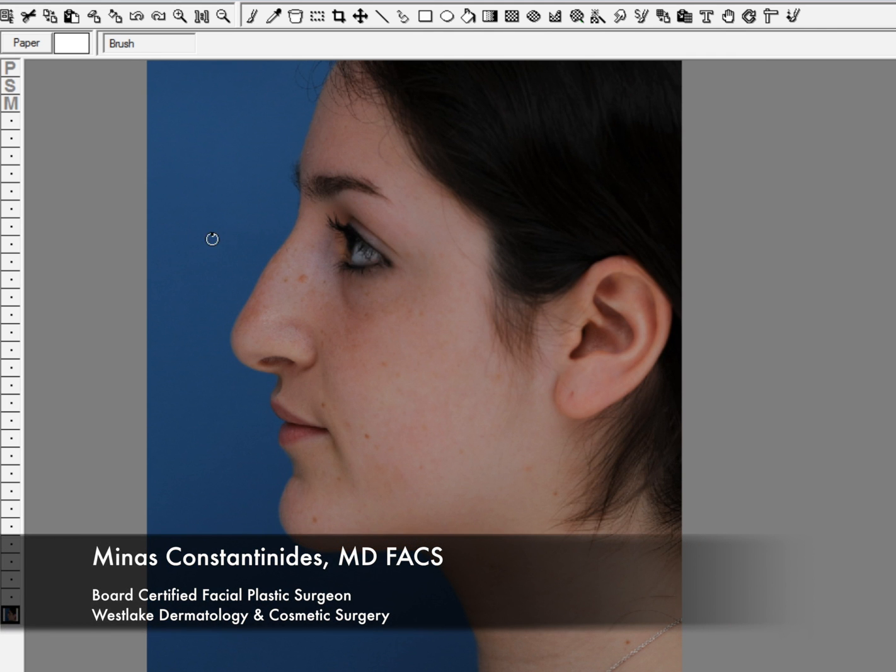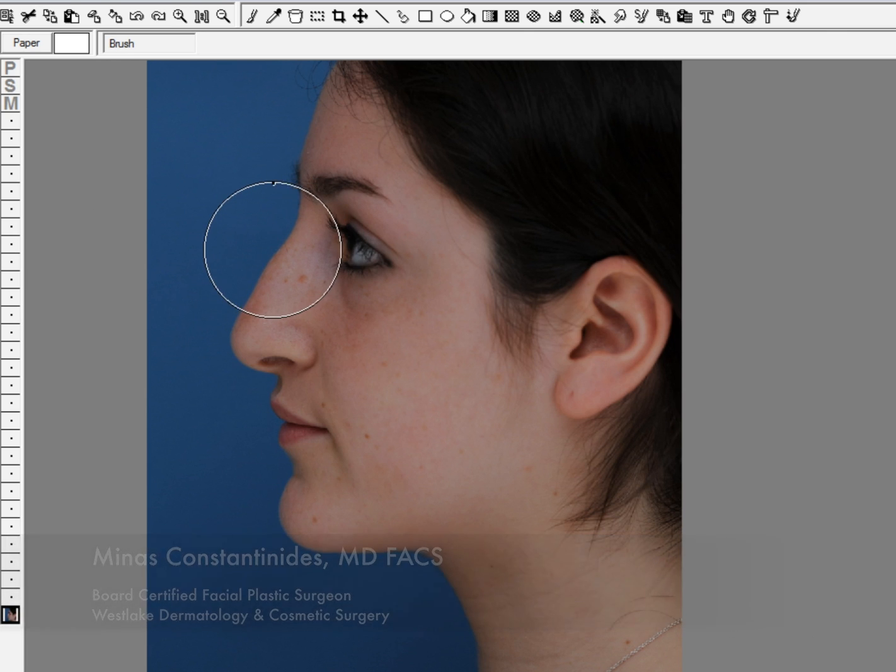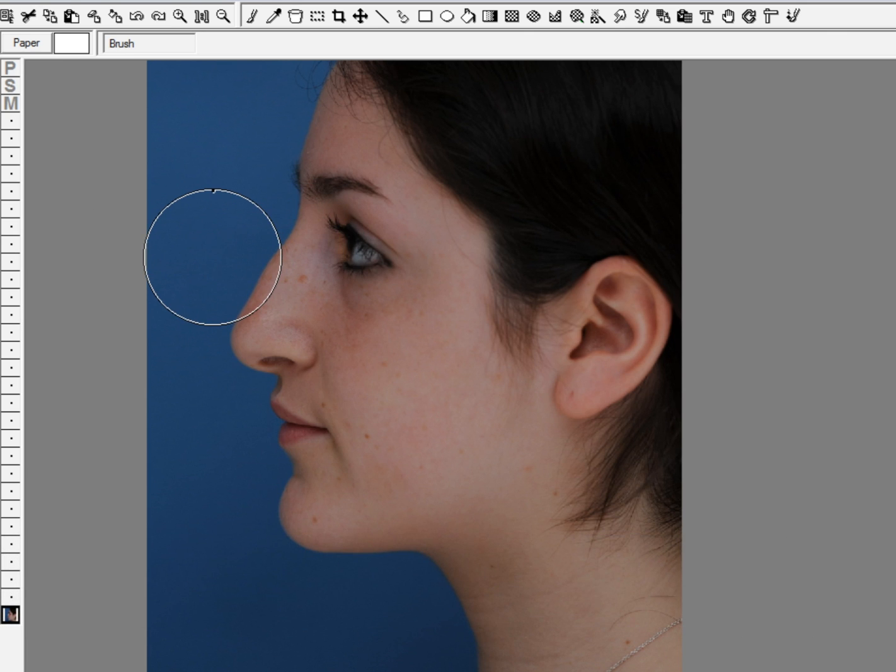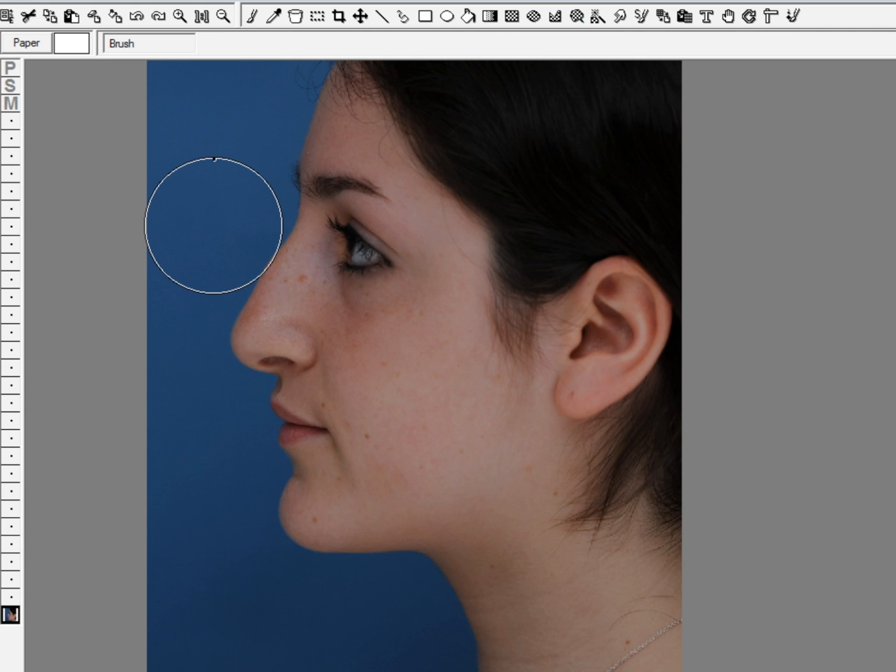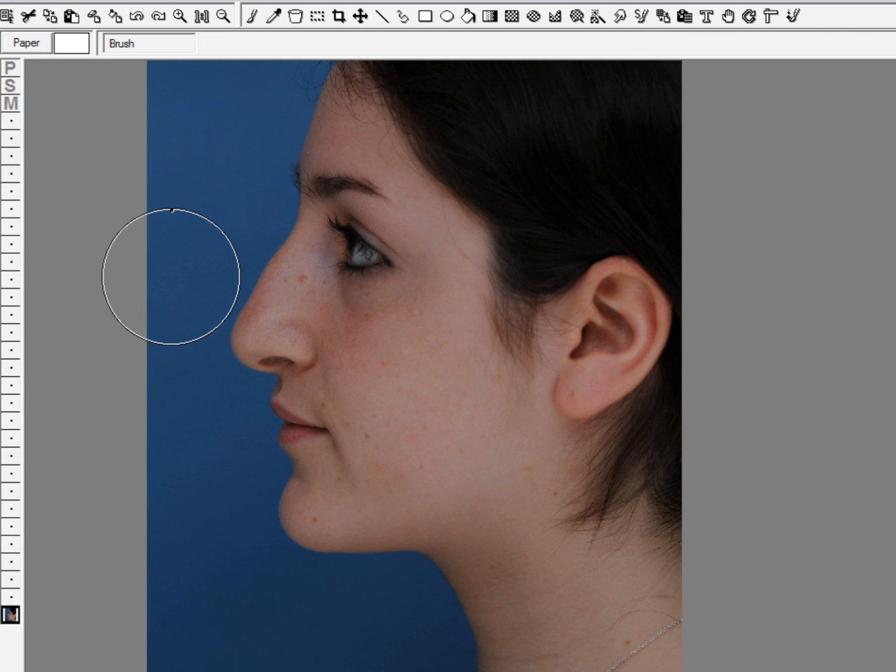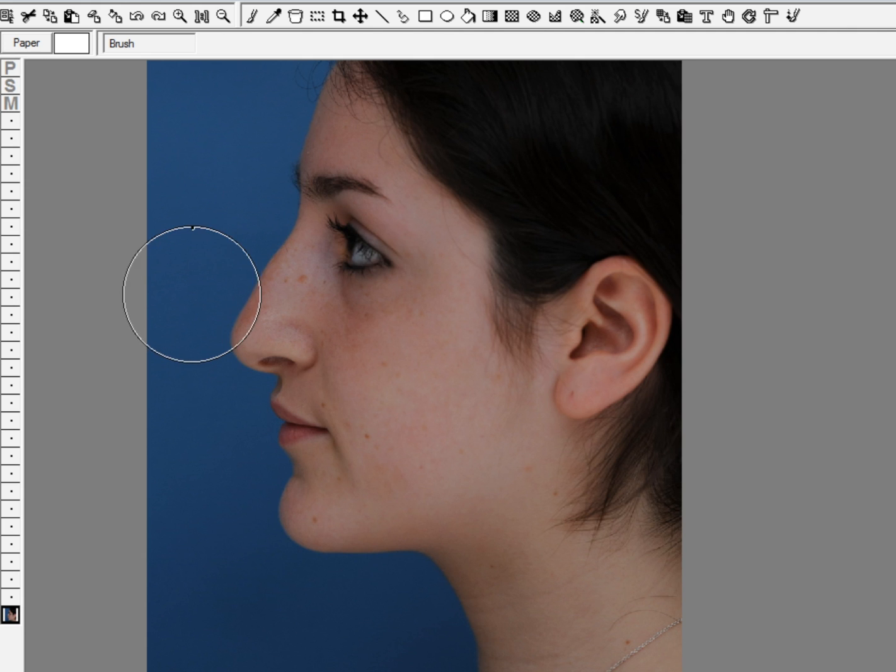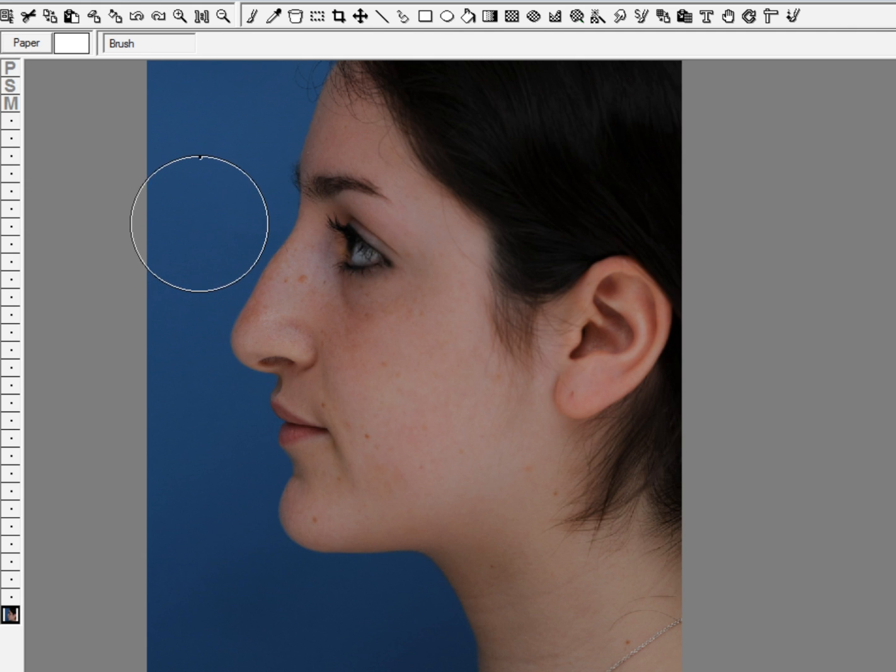This is Dr. Constantinides and today we're going to show how photo imaging works for rhinoplasty. This young lady wanted to have a smaller nose for her face and a straighter ridge without as much of a bump, and she also wanted a little bit more of a shorter nose. So we're going to show how photo imaging can help to give an idea about what surgery can do.